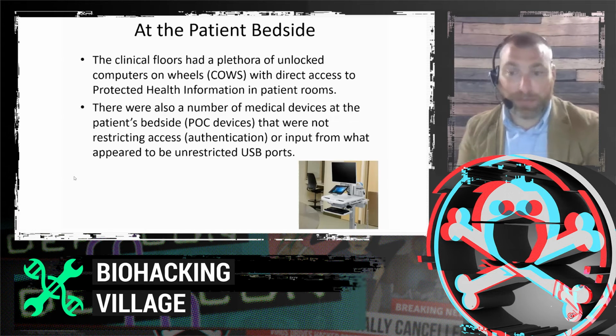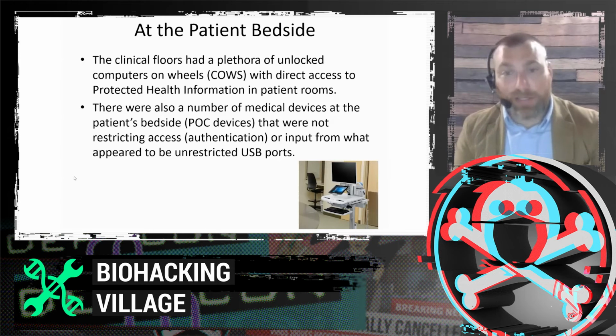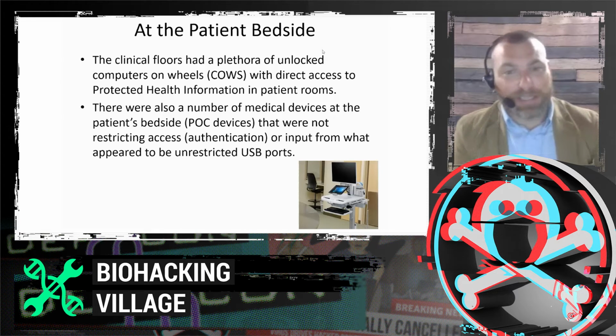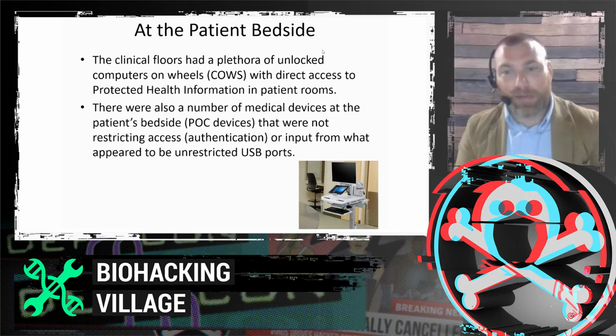A number of hospitals do lock down all their computers on wheels and have a timeout to lock them out after inactivity. But in this case, the devices were open. That's not a picture of the device; that's just one I took off the web. And there were a number of other medical devices at the bedside that had USB ports that, if you look at the device and Google it, you can probably identify that it doesn't restrict any type of traffic. So if you had a Rubber Ducky, things like that, you might be able to either extract data out of the device or potentially run a script on it.